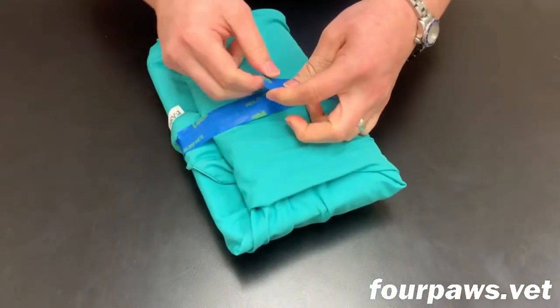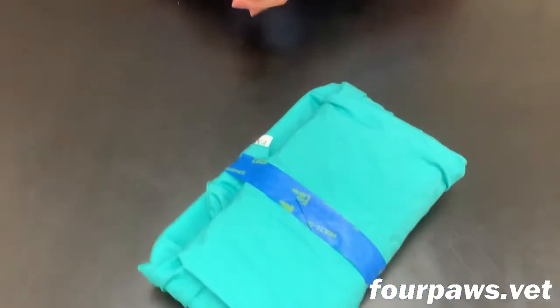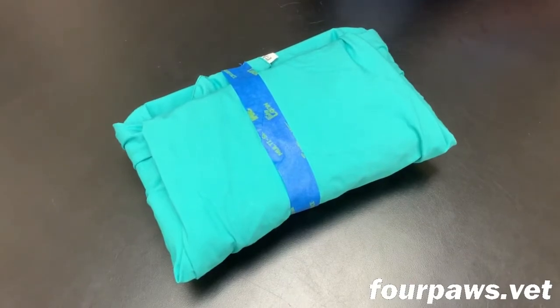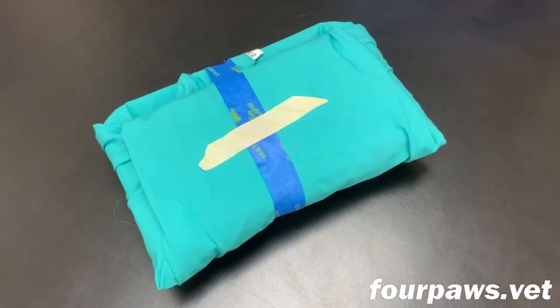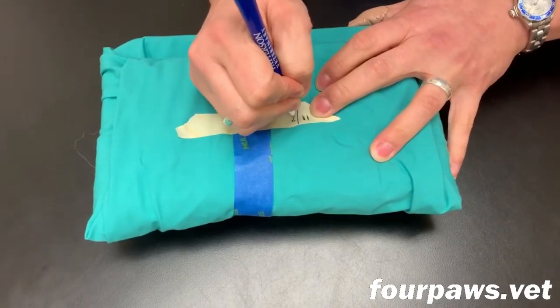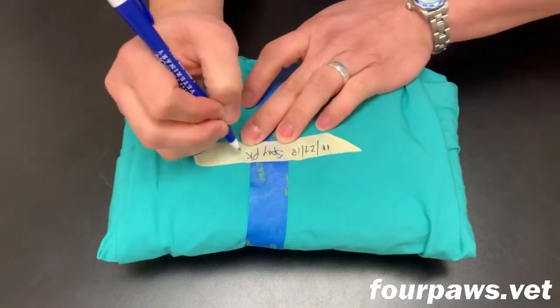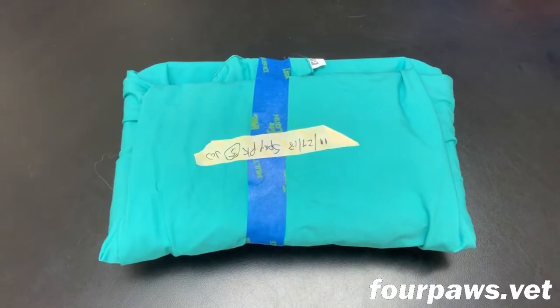Finally, some tape is applied to keep the pack wrapped snugly throughout the sterilization procedure. The blue tape is just plain old painter's tape, but the most important part is applying a strip of indicator tape. Just like the indicator strips inside the pack, the indicator tape will let us know when this pack has been sterilized properly. The assistant always writes the date it was prepared, what the pack is and what kind of instruments it contains, and also their initials in case there are any questions about the contents of the pack.